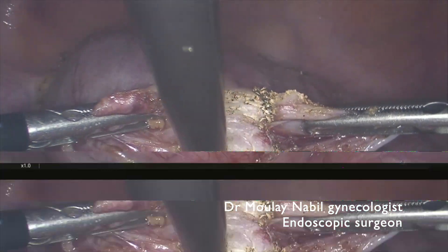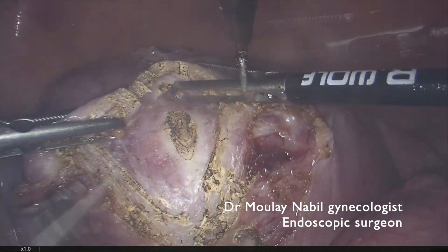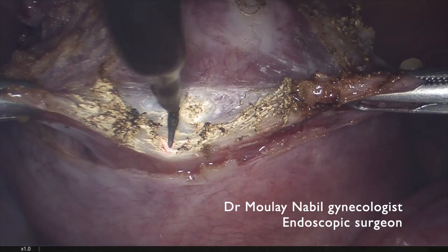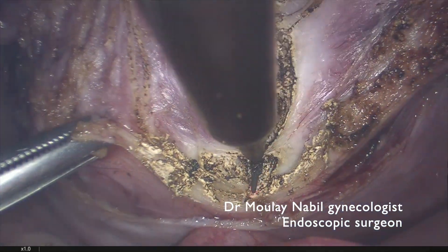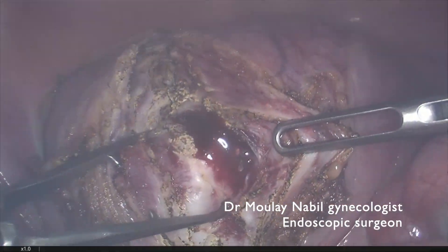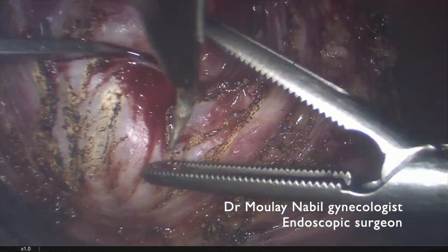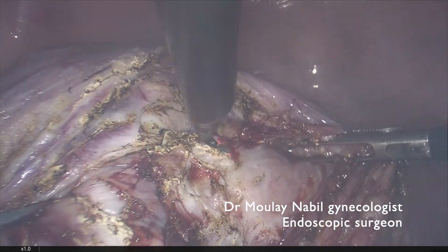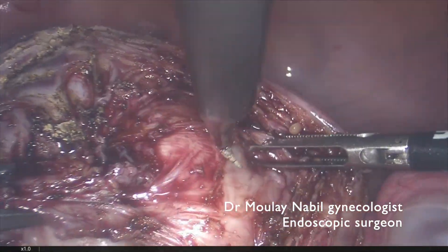Our goal is to reach the myoma, so we have to cut the capsule and reach the myoma plane. This is the capsule plane and this is the myoma plane. After reaching the myoma, we use a 10 millimeter Pozzi forceps that allows us to do lateral traction, and we apply the energy — monopolar — only on the myoma and never on the healthy myometrium.